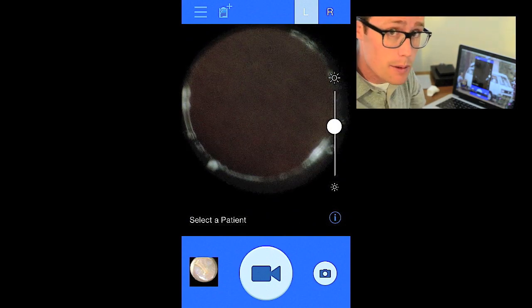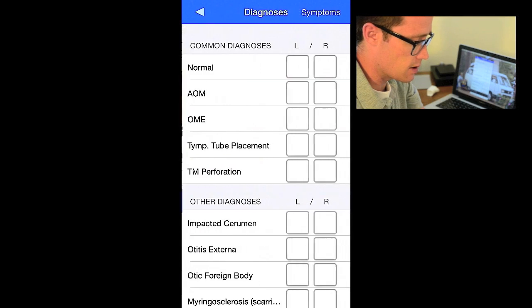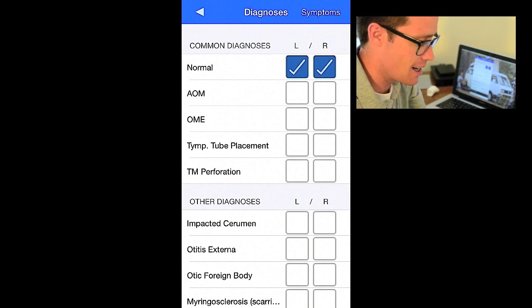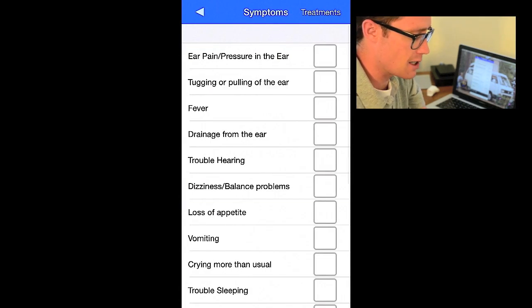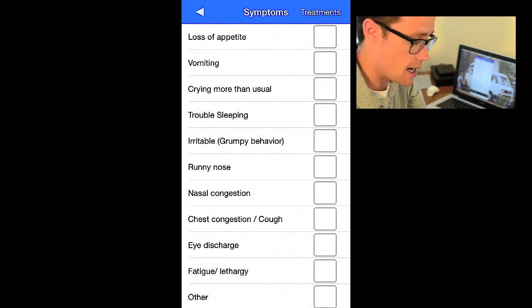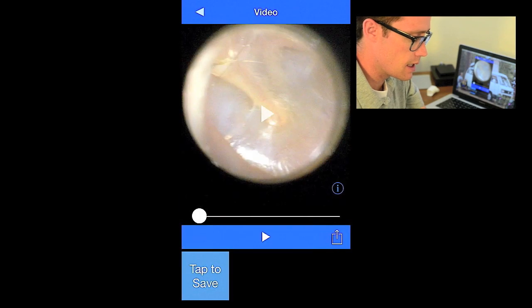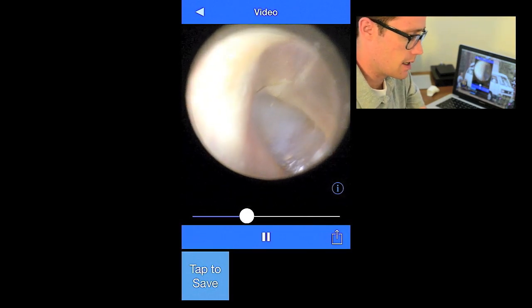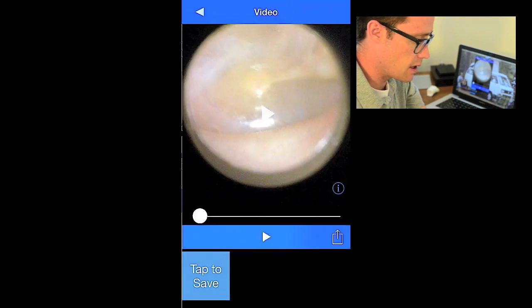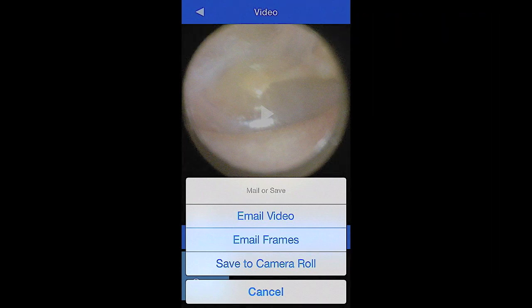That's how easy it is. I have to remember to straighten out the ear canal, but other than that there's no problem at all. I'll click a diagnosis — I think it's pretty normal for both my ears, though there's some scarring from my eardrum exploding when I was a kid. If I wanted to, I could go into symptoms, especially for a pediatric patient — ear pain, fever, trouble sleeping — which might help on the analytics side for keeping records. Then I can review the video right on the phone and show the patient's parent or the patient themselves, switch to the other ear, view the video, and email a few frames or the whole video, or save the video to my camera roll.